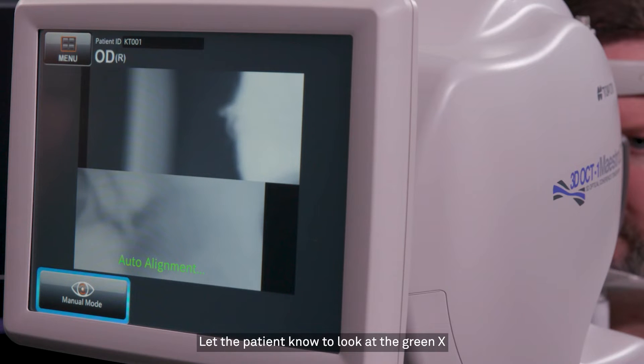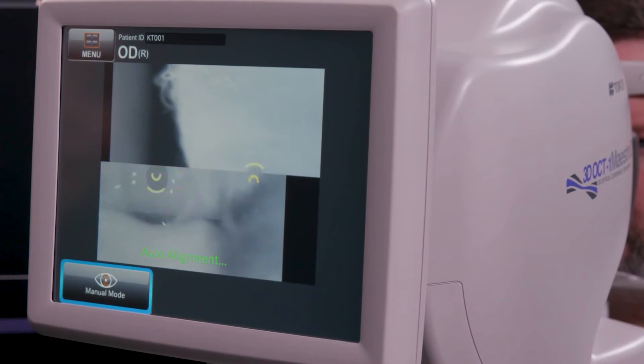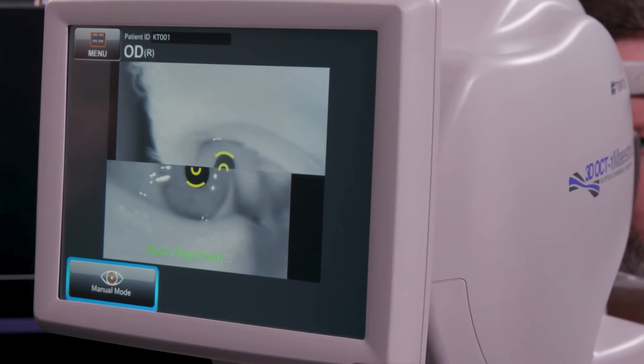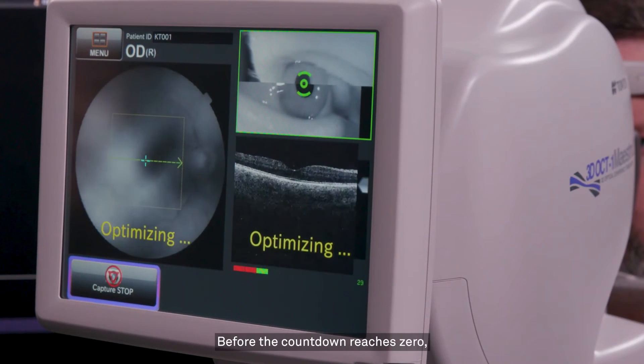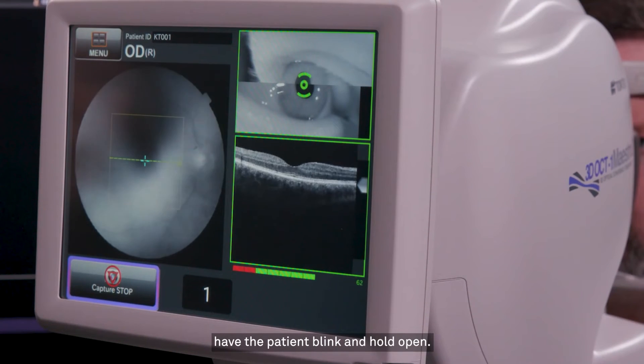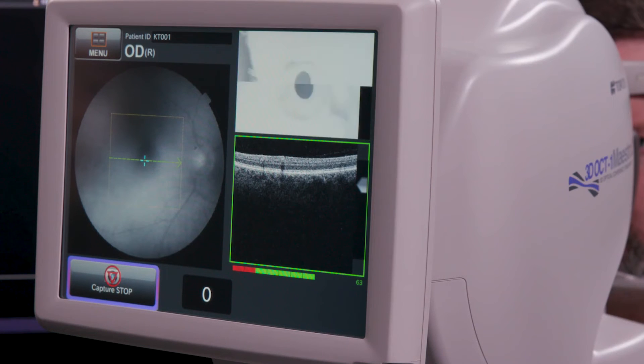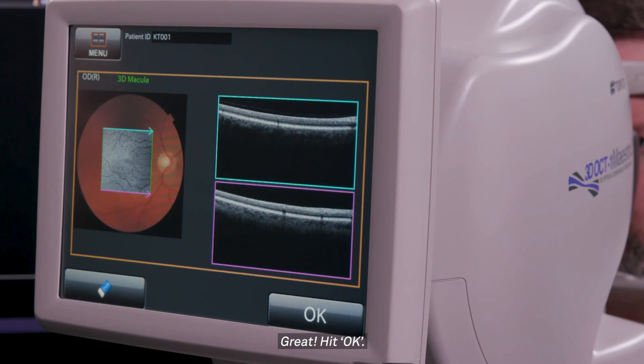Let the patient know to look at the green X and to blink normally. Before the countdown reaches zero, have the patient blink and hold open. Great. Hit OK.